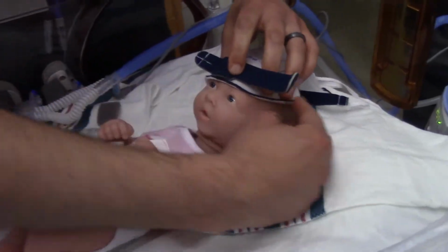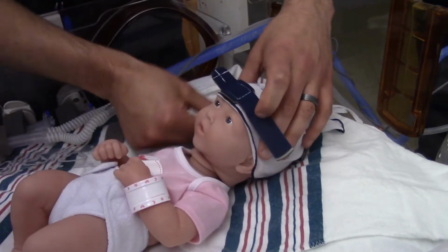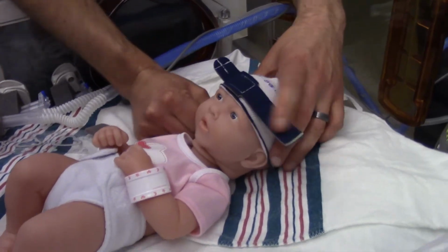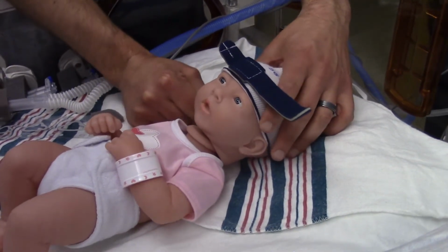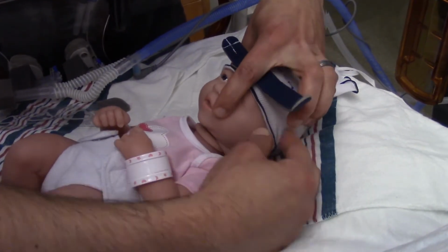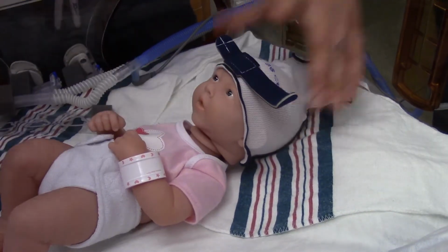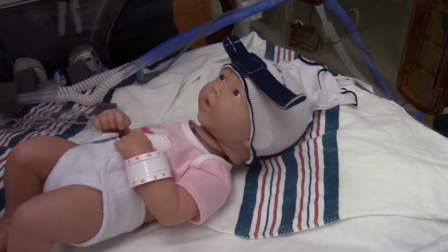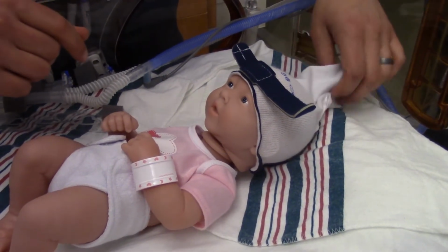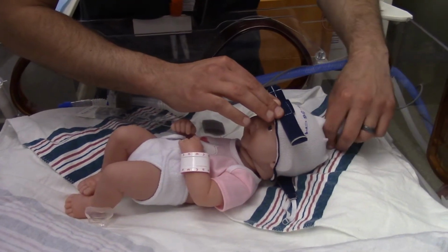We want to try to make sure that we're as down low as possible towards the back of the head, because that's going to give us our most secure and best fit. So that right there is about how we want to look with the bonnet on. Bonnet serves two purposes. It holds our interface and it also maintains the baby's heat. So we have our bonnet on, we're ready to go.